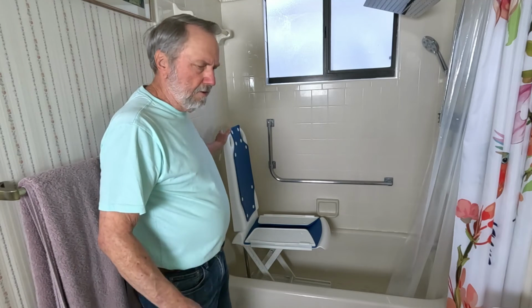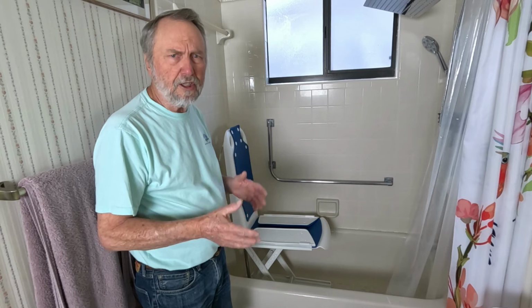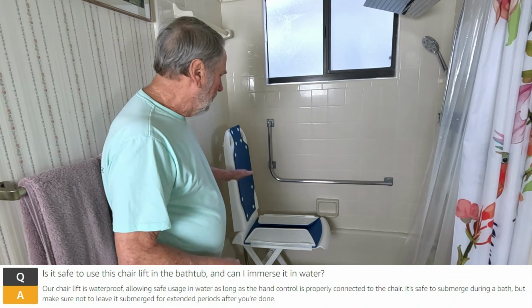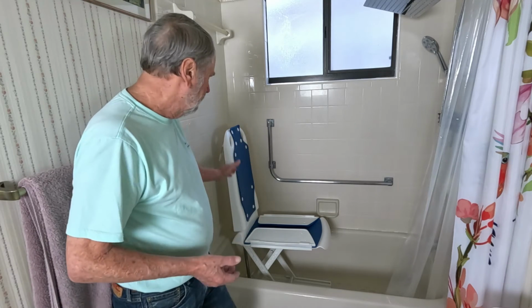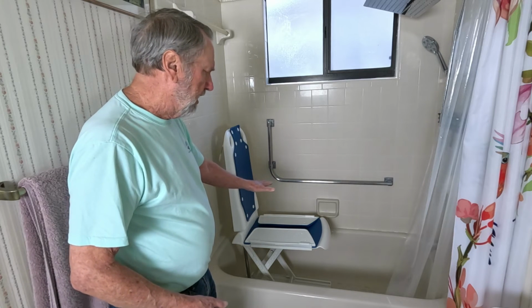Okay, folks. The bathtub is a planned event where a person is going to take a bath, a soaking bath. So you would want to have the chair in the highest position where the back is straight up, and the seat is as high as it can go.